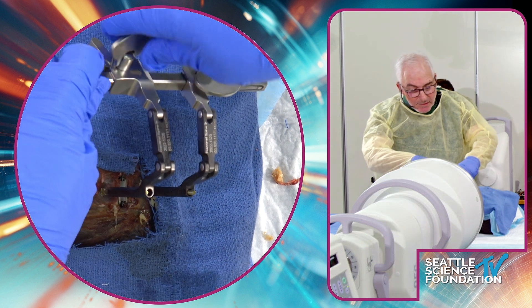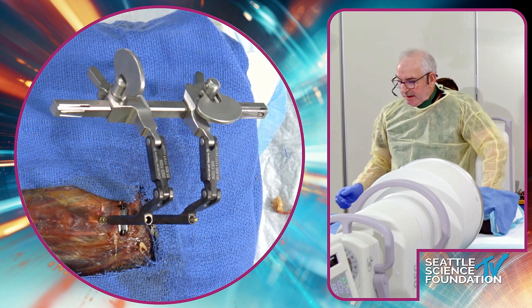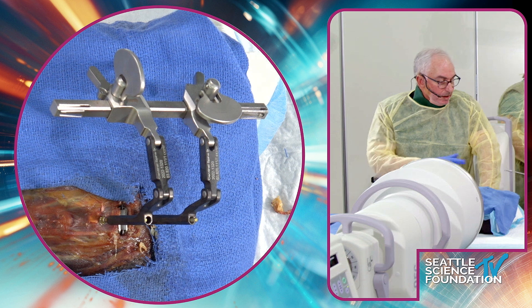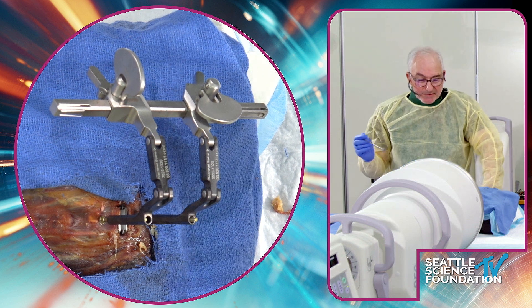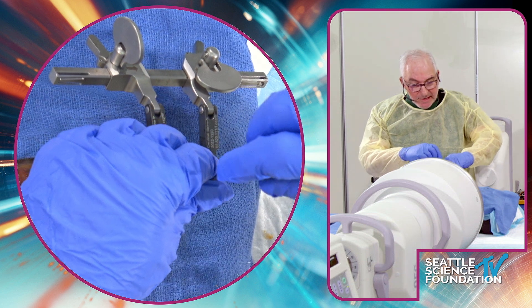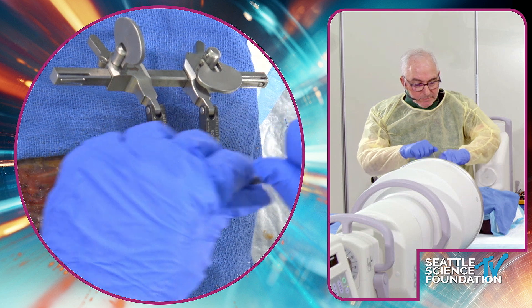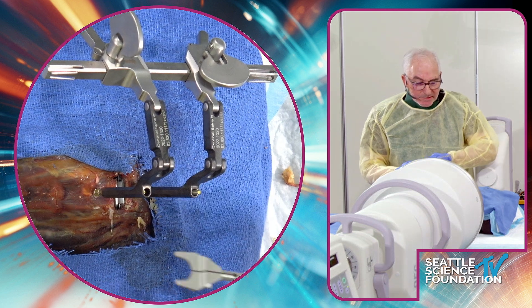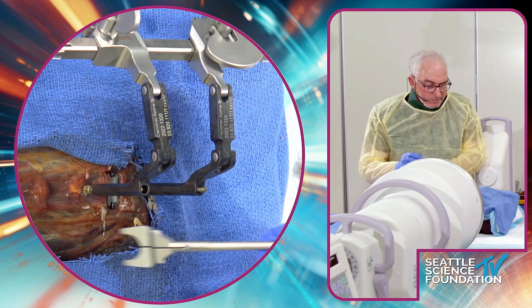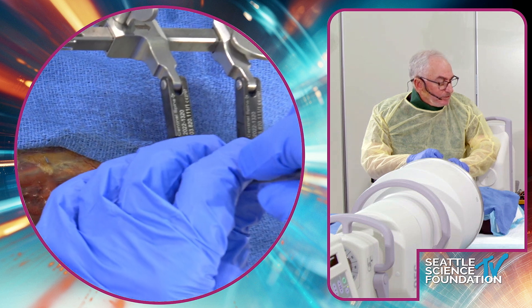You want to know which disc you're removing because you might need the original company's removal tool. In this case, Centinel is nice enough to give us a removal tool to take this disc out. As Dr. Ziegler said, that's one of the biggest game changers with cervical versus lumbar — the ability to revise. We'll gauge the end plate and use the inserter.